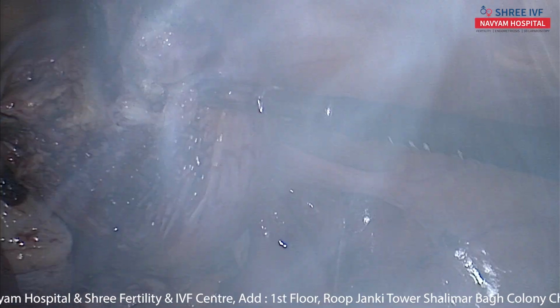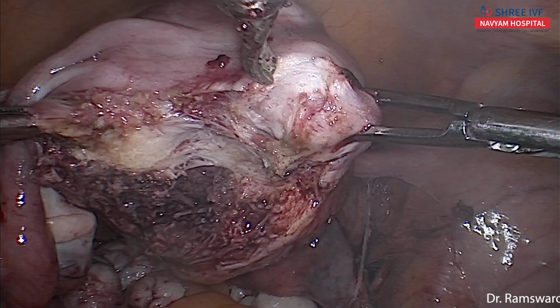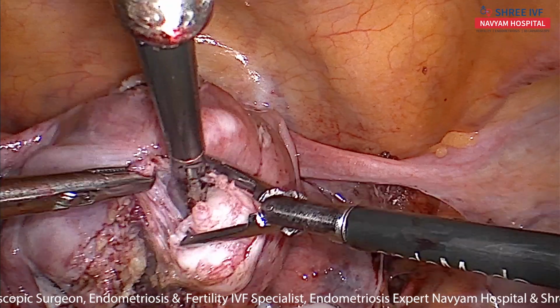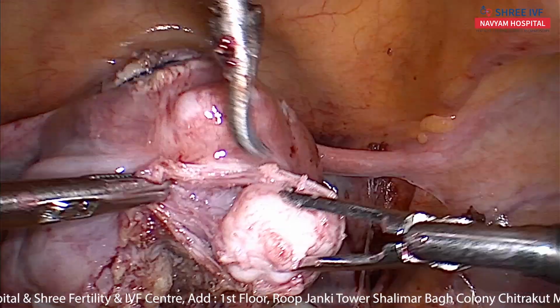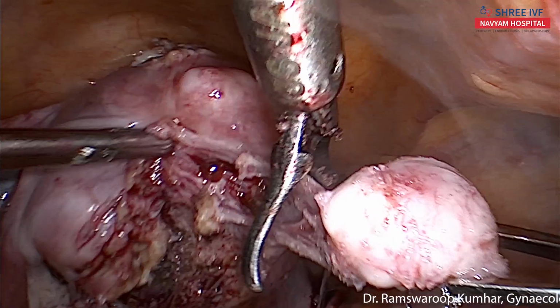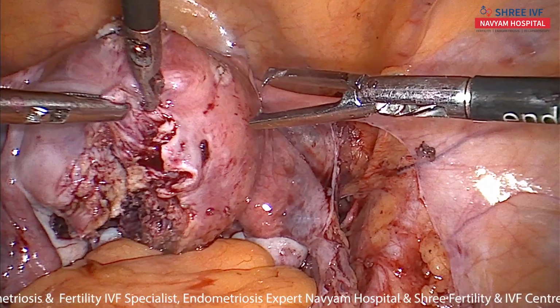Okay, hold this tissue. First remove this. Hold it. Which number? 11 myomas are out. This is a smaller myoma.